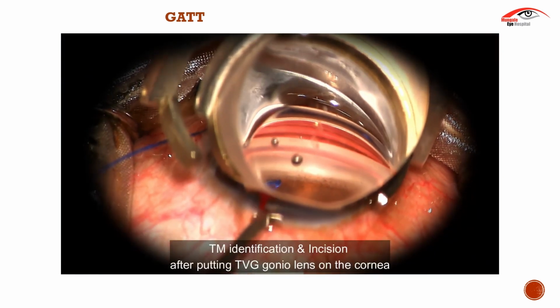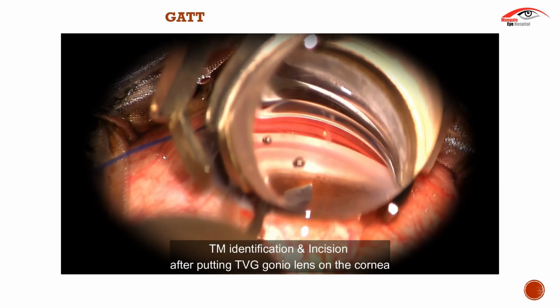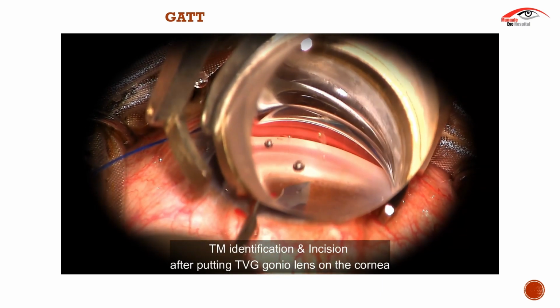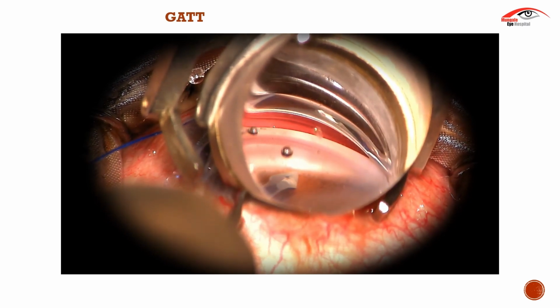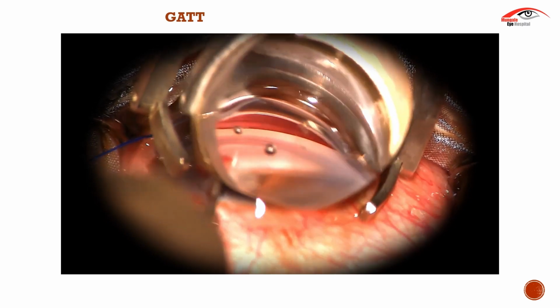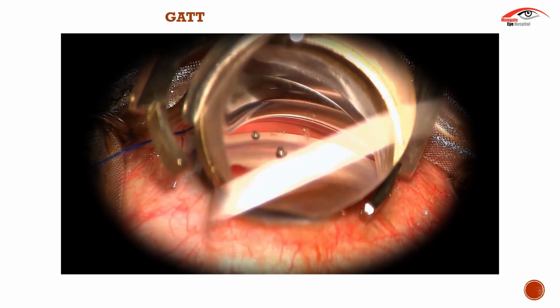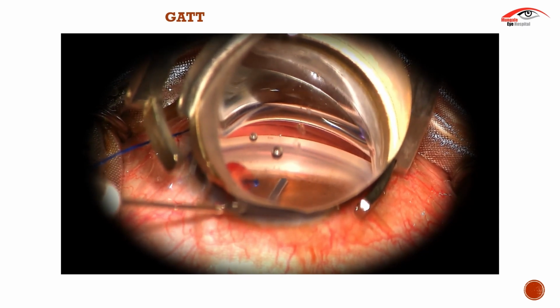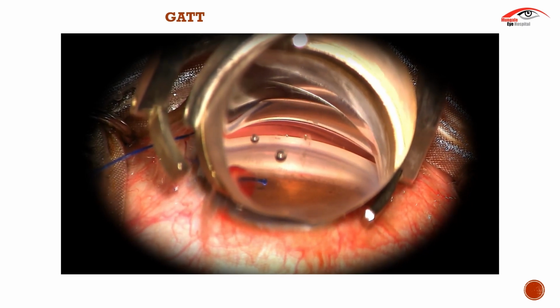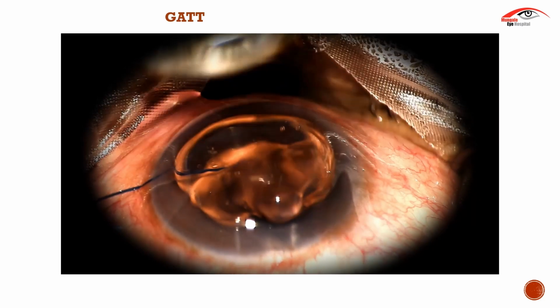The trabecular meshwork is visualized with a TVG gonio lens placed over the cornea over a blob of viscoelastic. After visualization of the angle, a nick is made with the MVR blade. Cohesive viscoelastic is injected into the Schlemm's canal through the nick.